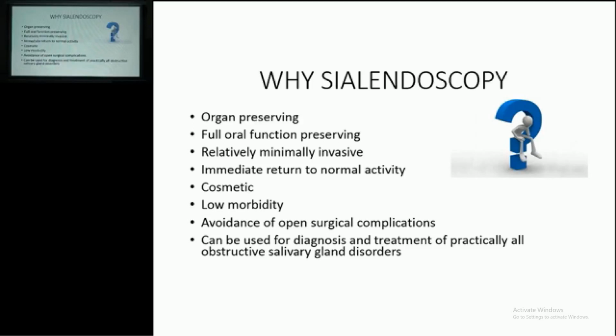So today, pretty much you can cover all; it can be used for the diagnosis and treatment of almost all obstructive salivary gland disorders. Of course, the caveat being you need to have the instruments to be able to then tackle that obstruction.